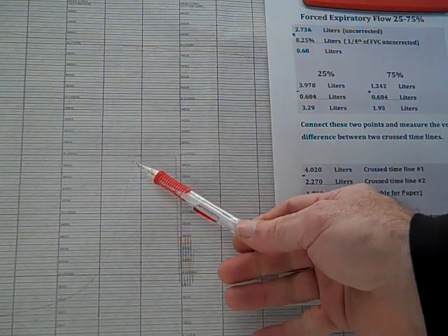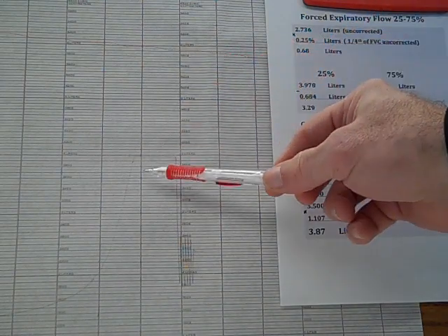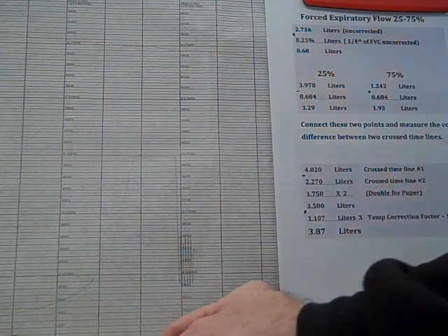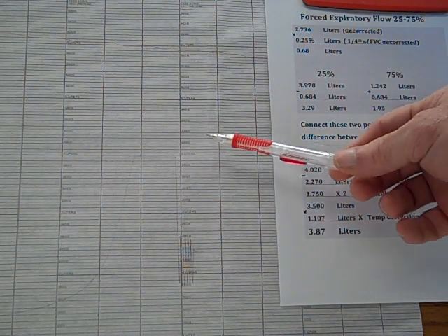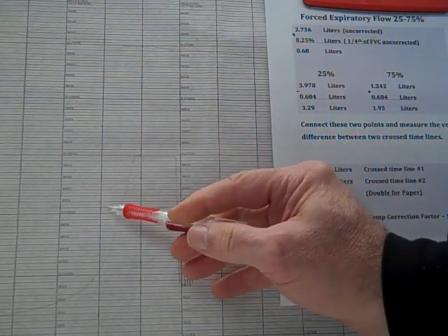That point will tell us at the 25% level from the top, that is the 25% of the vital capacity, and then we're going to go 25% up from the bottom. That will leave us the middle 50%. When we take 25% from the top, we'll put the liters at about 3.29 liters, and we'll find our spot, and we'll put it there at 3.29 liters.